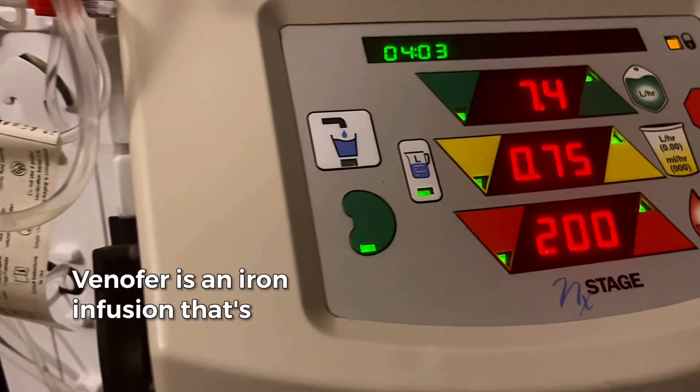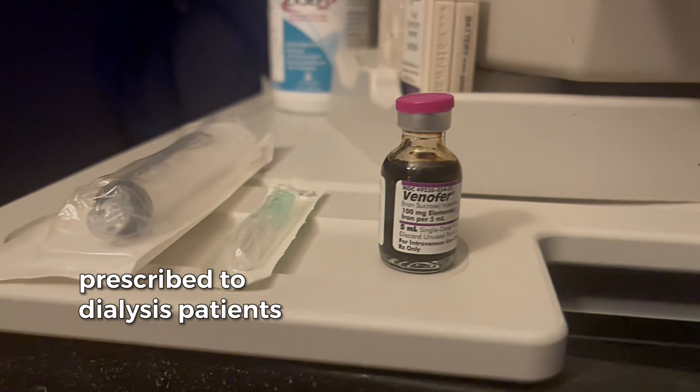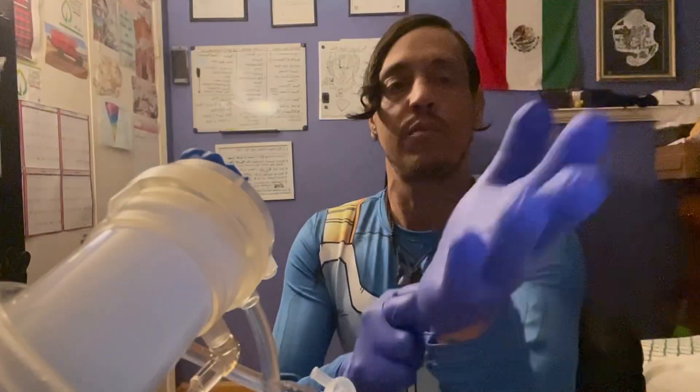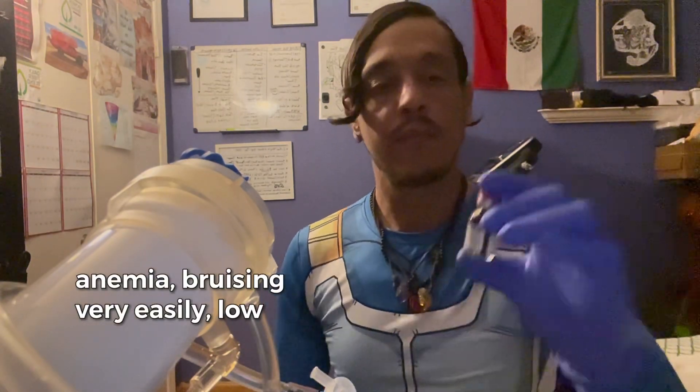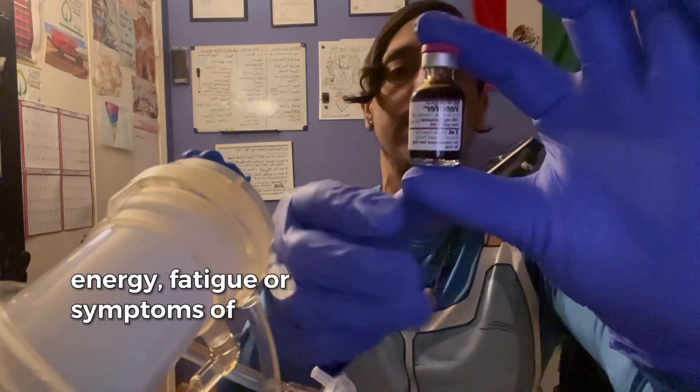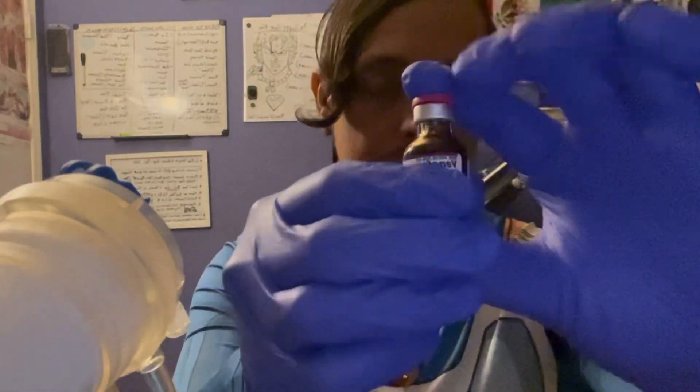Venofer is an iron infusion that's prescribed to dialysis patients when our hemoglobin or our albumin is low. Anemia, bruising very easily, low energy, and fatigue are all symptoms of low iron.